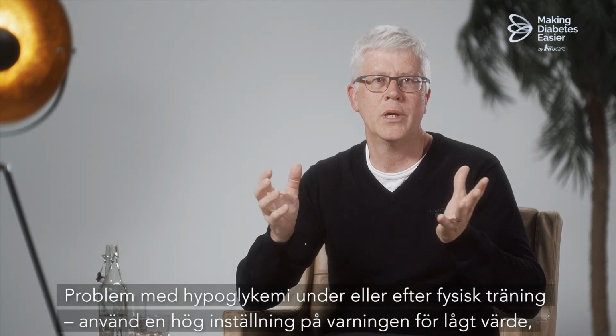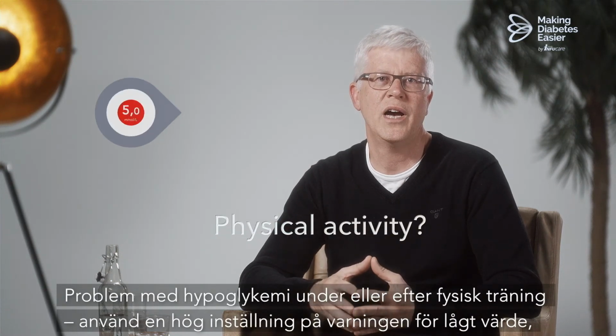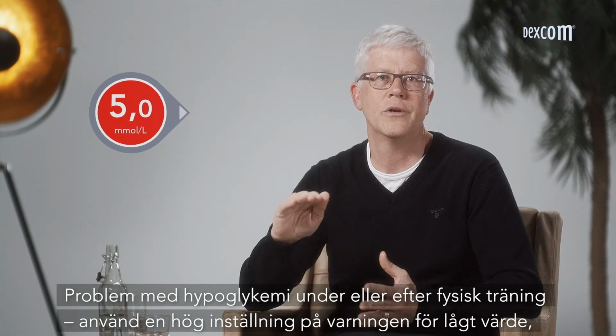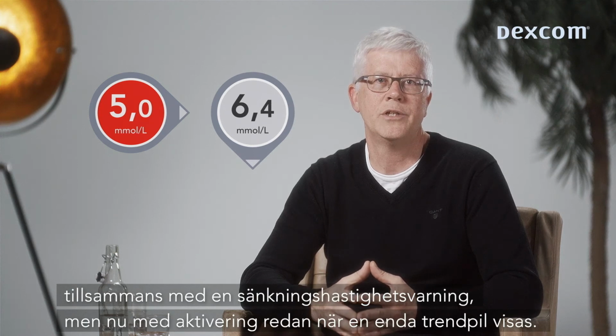Problems with hypoglycemia during or after physical exercise. Use a high level of the low alert along with a rate of fall alert, but now with activation already when a single trend arrow is present.